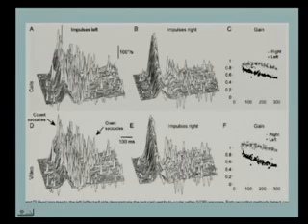The profile of the residual vestibulo-ocular reflex is very similar, and if it's plotted as gain, you can see here straight away this is the affected side in dark, which is the off direction of the remaining canal, and this is the on direction, and you can see the gains are very, very similar, both with video and with coils. So in most patients, you can get diagnostic results using a video system for measuring head impulses, and it's possible to recognize those patients with covert saccades who have a false negative head impulse test.